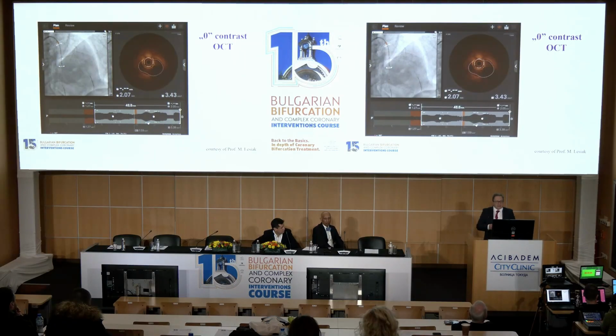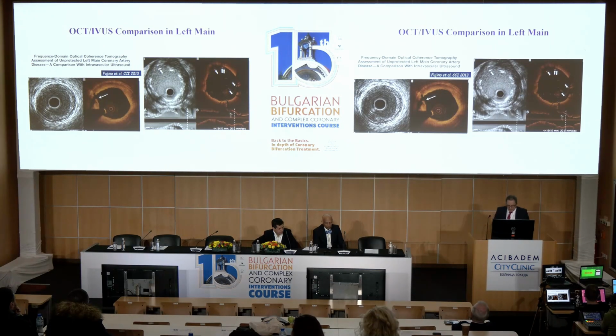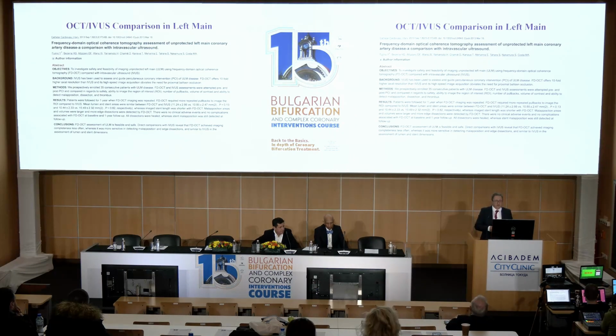We are able to recognize all of the needed details. So the usage of saline infusion or dextran, it's feasible. We can avoid this nephrotoxic impact of additional contrast medium. But if you look at the precision and details on these both techniques, you can appreciate that this is the truth. With OCT, we see better. This is for sure.